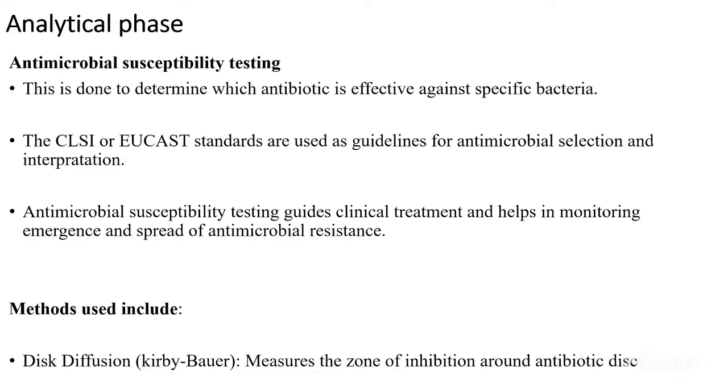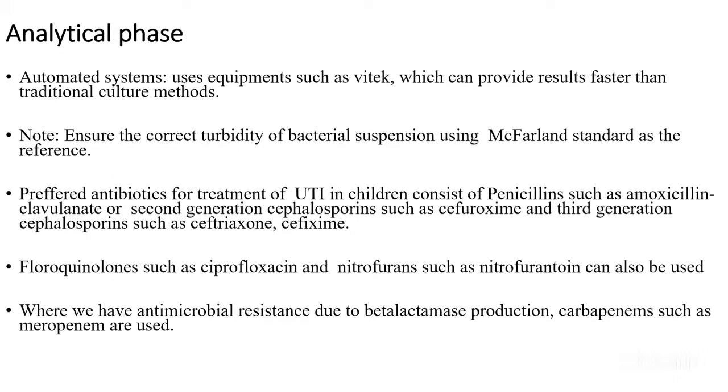If a drug is placed in a plate that has been swabbed with a bacteria, and incubated overnight, if the drug is effective towards the bacteria, there will be a zone of inhibition where the bacteria will not grow around that drug. So in the morning, you'll come and measure the zone of inhibition around the disc.